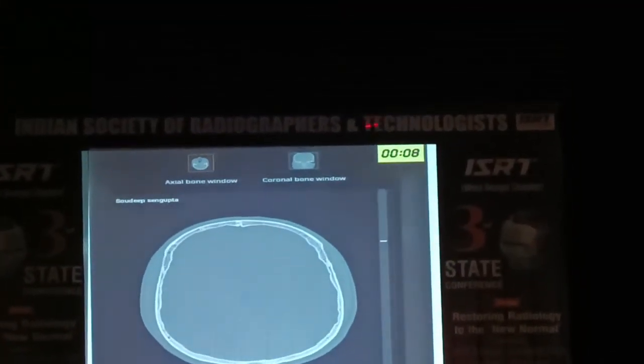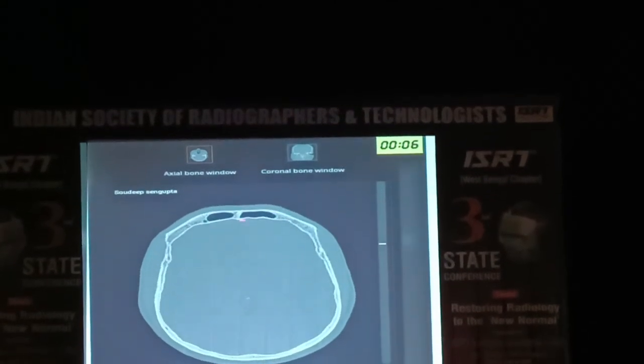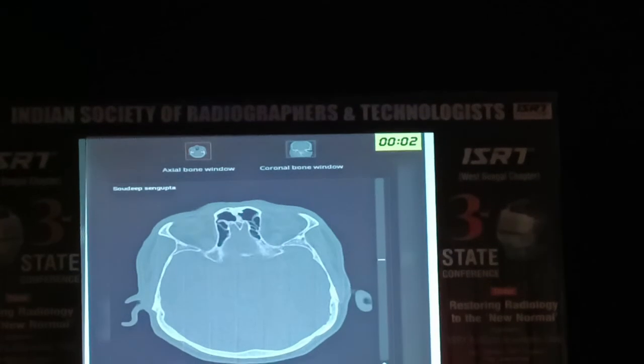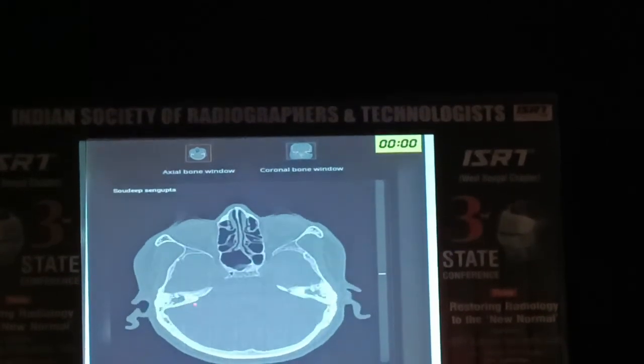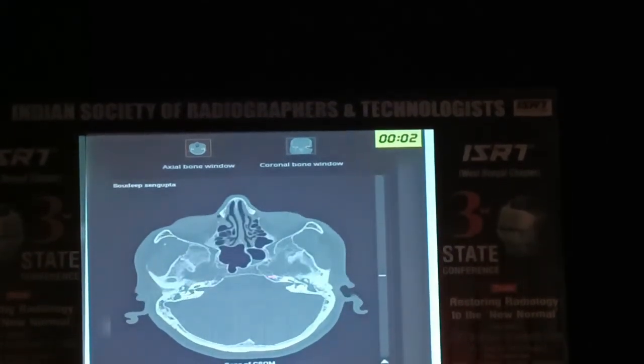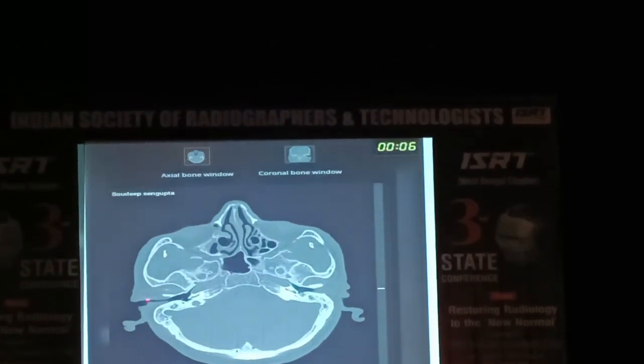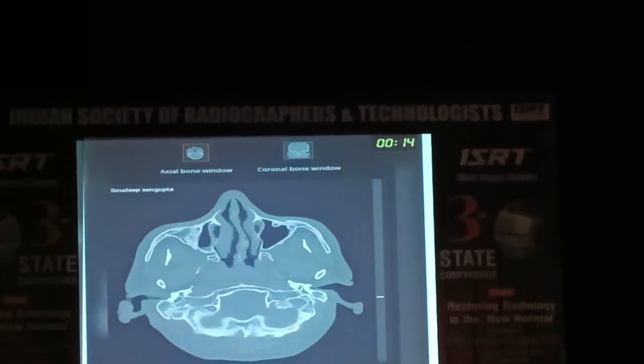These patients come with a history of trauma in the left ear and also a sensation of hearing loss. This part is totally occluded, and this part of the external auditory canal is completely diminished. So in that case we can say this patient is suffering from traumatic injury, and later on developed an acute CSOM.